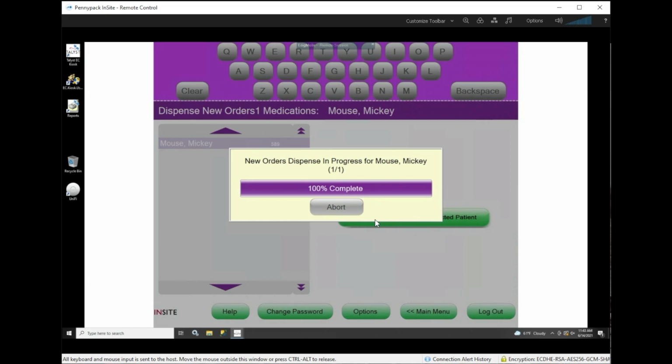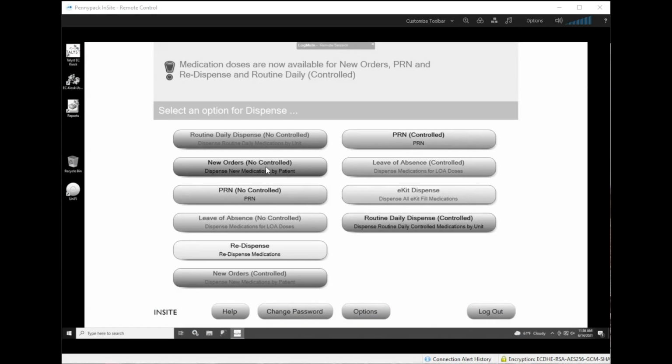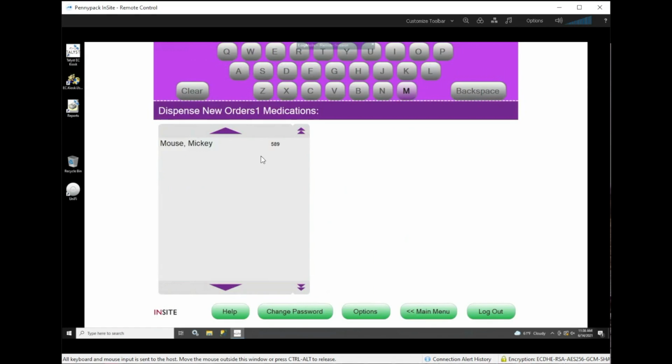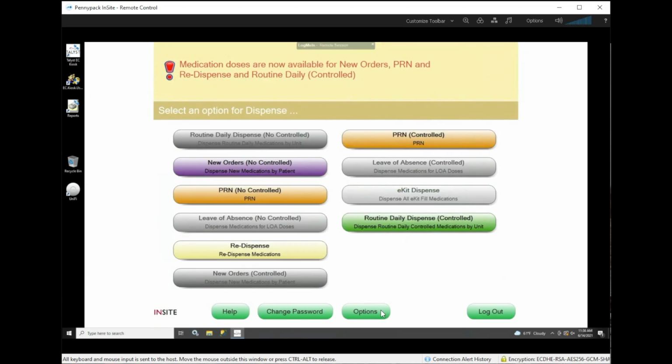Now, in the next issue, we're going to show you the third most common thing. So there's the jam, the kiosk lockdown, and then there's the can on the shelf. Can on the shelf is basically where, when I showed you how to put the canister back on the base, you didn't put it on there correctly, or someone left it off the base somehow. So the machine doesn't know where the canister is because the computer chip in the canister is not making contact.